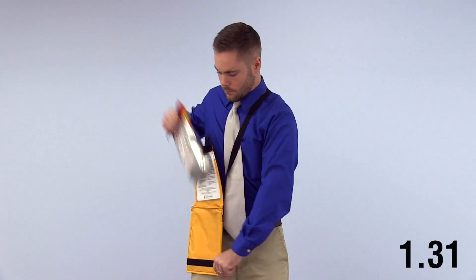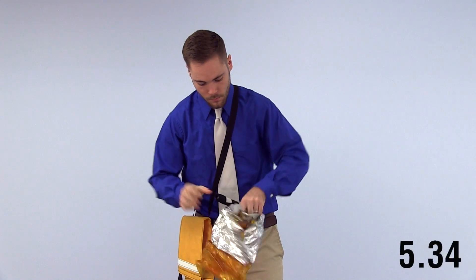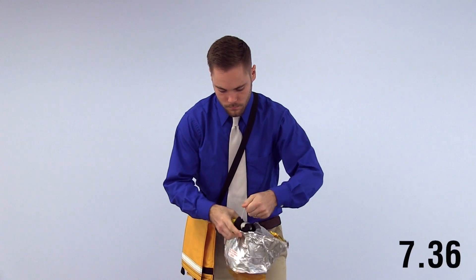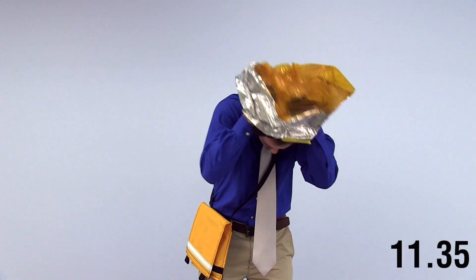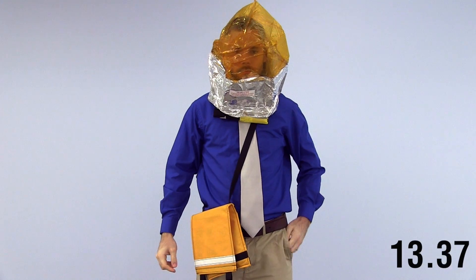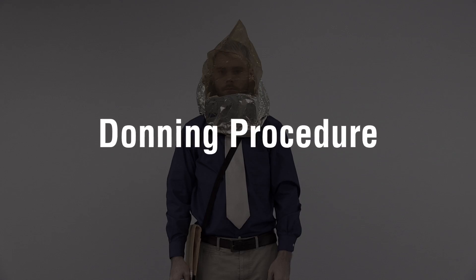It takes less than 15 seconds to don a hood. Let's review the process.